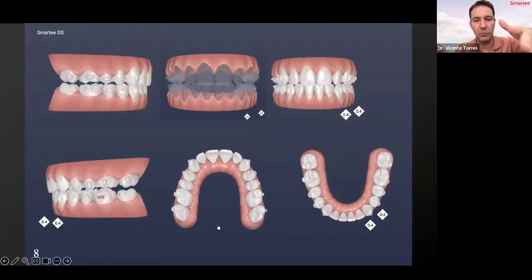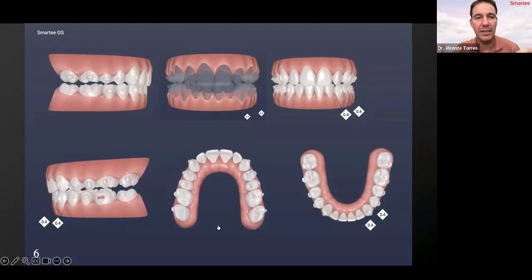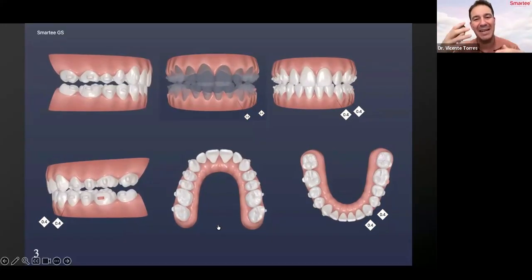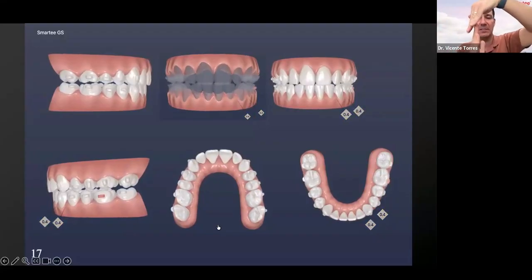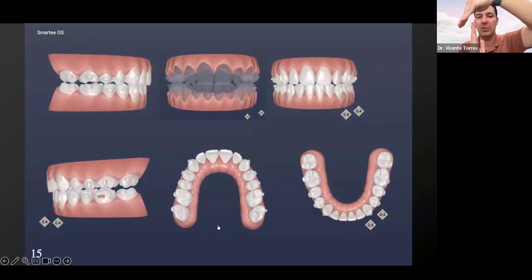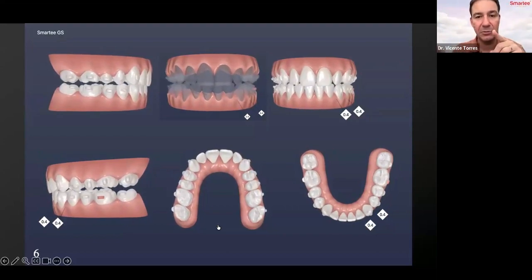Of course, here you can see at the end this virtual jaw. Every virtual jaw is virtual, it's not real, but it gives you an idea of how it's going to correct. The most important thing is first to remove the anterior contact. So in that case, in class II division 2, we increase the torque of the teeth.